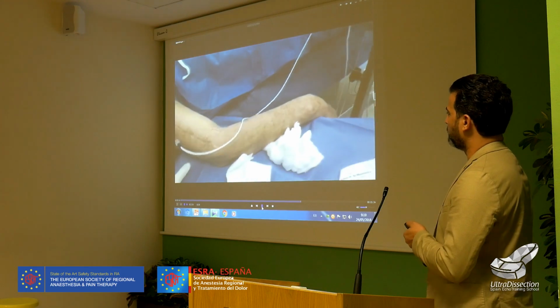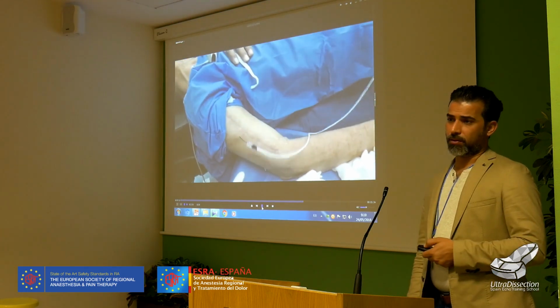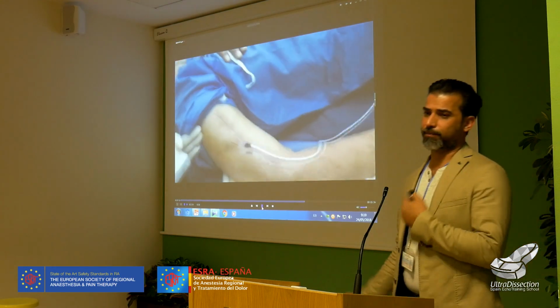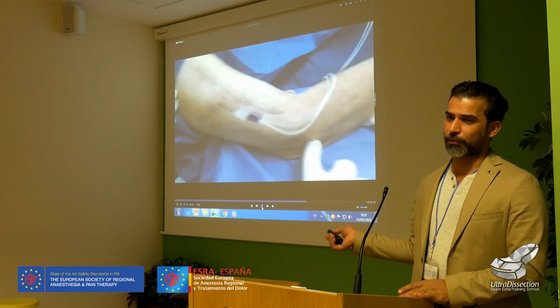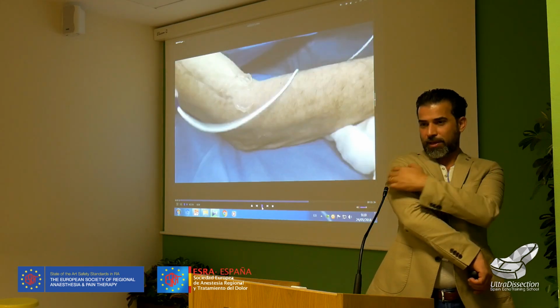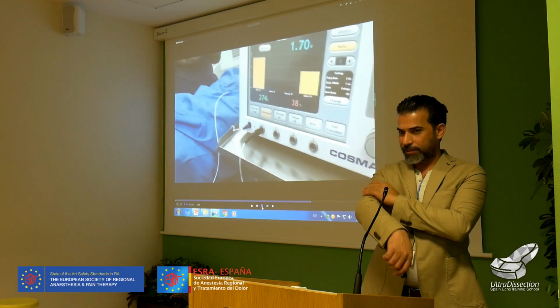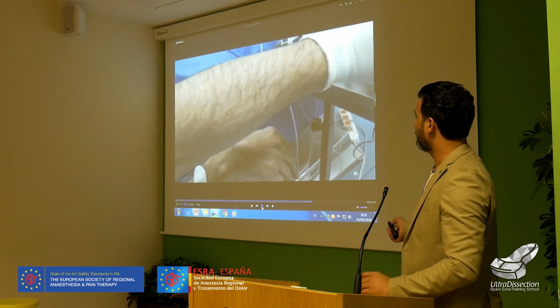So 3 volts. See the triceps muscle? See the triceps muscle? No, extensor, just the triceps. But the extensor didn't work here, because the stump of the nerve just reached here, the muscular branch of triceps. And here there is no regeneration, so zero conductivity.